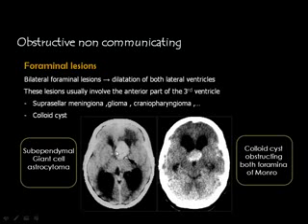Also an important lesion which is also well known, which is the tumor occurring in patients with tuberous sclerosis. Here you can see calcification in the wall of the ventricle, denoting the presence of tuberous sclerosis. Then a tumor which has a characteristic location and shape. The tumor is homogeneously enhanced and is located in the frontal horn of one of the lateral ventricles, and because of the size of the tumor, it encroaches on both foramina of Monro. Then you get bilateral foraminal obstruction and dilatation of both lateral ventricles.